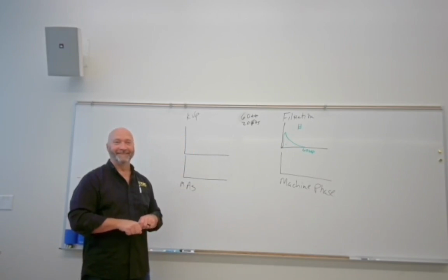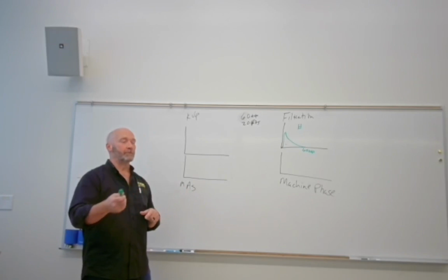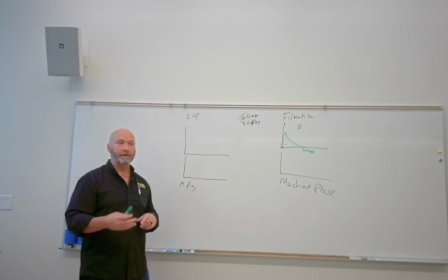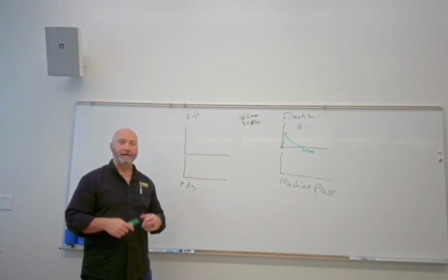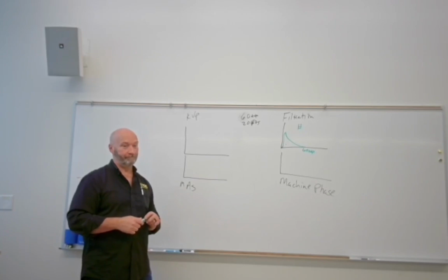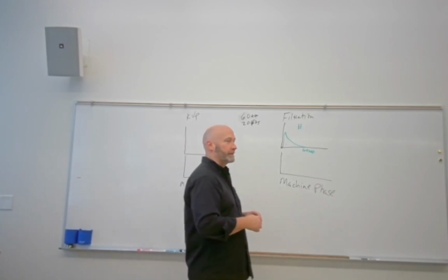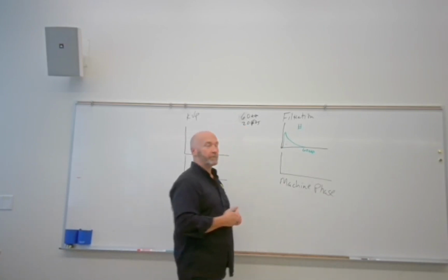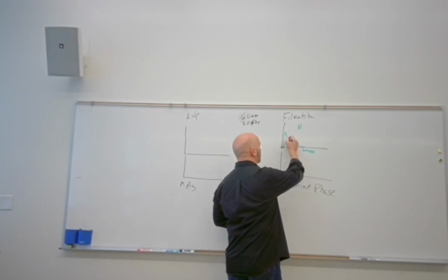What is it? I mean, what's it similar to? What are you made out of? Water and fat. Right, we got a lot of fat. So you cook the fat down, what do you get? Oil, right. You absorb X-rays? Yeah. So does oil absorb X-rays? It's not radiopaque, it's radiolucent. So it's going to absorb some, and now your Brems spectrum looks like that.